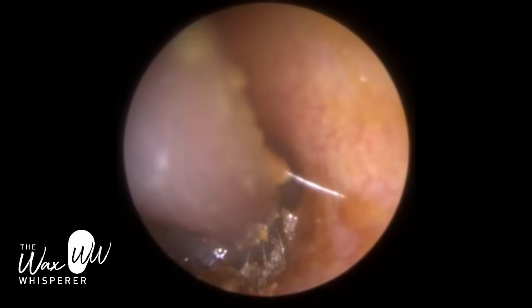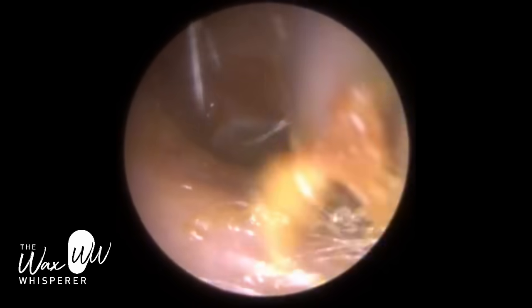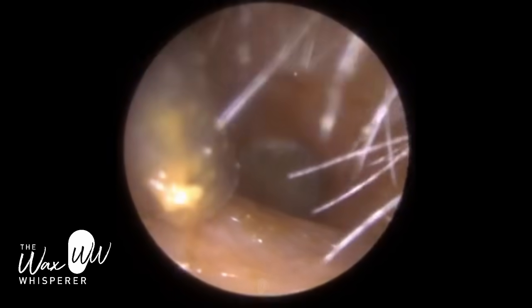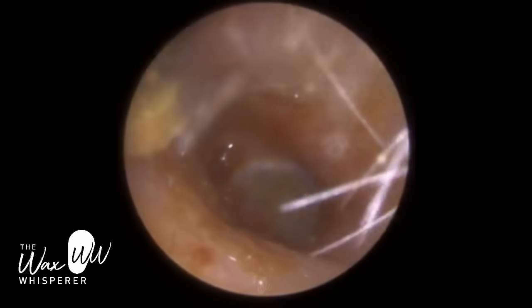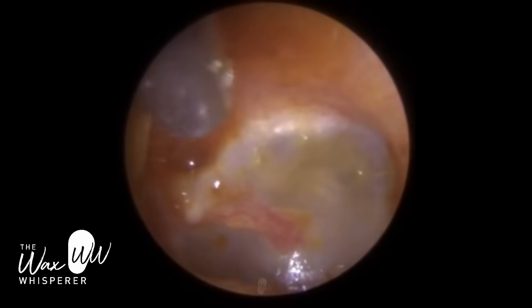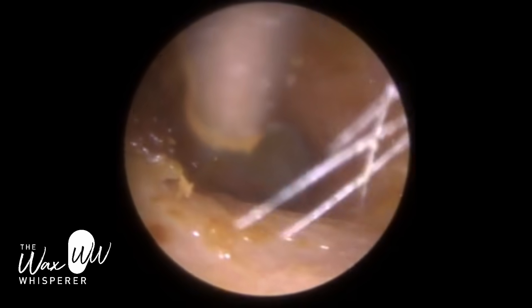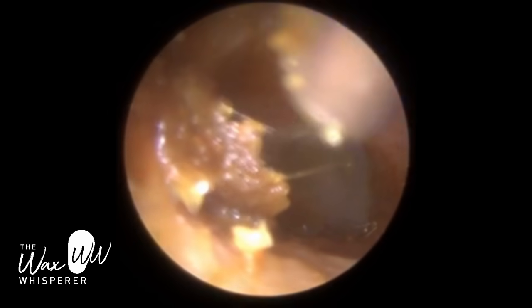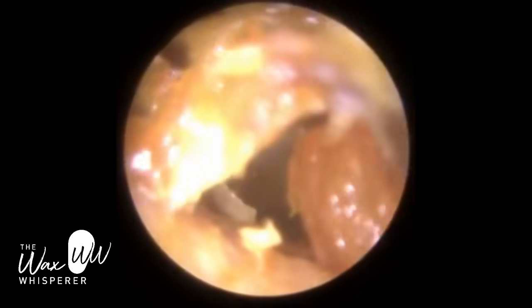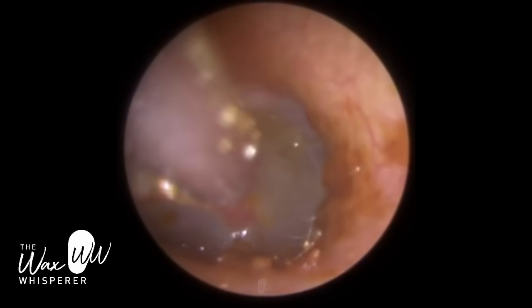The tympanic membrane is fully visible. The patient is hearing significantly better. I just want to mop up around the edge. The patient had been using drops prior to attending, and the day before attending he unfortunately used a cotton bud or Q-tip - cotton swab as they call it in America - which impacted this wax right up against his eardrum. He woke up in the middle of the night in a panic because he completely lost his hearing on this side. He was fearing the worst. Fortunately, it was just the wax impacted against the eardrum. The eardrum is otherwise healthy and intact - there's no trauma, it hasn't perforated or injured or bruised it. So it's very fortunate.